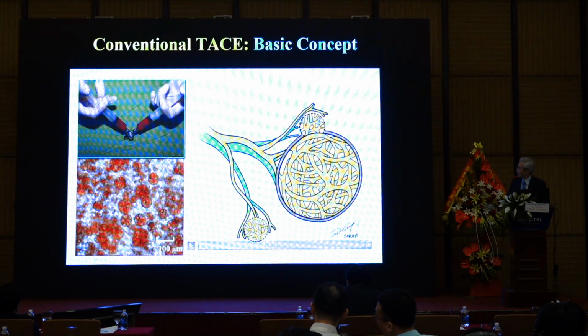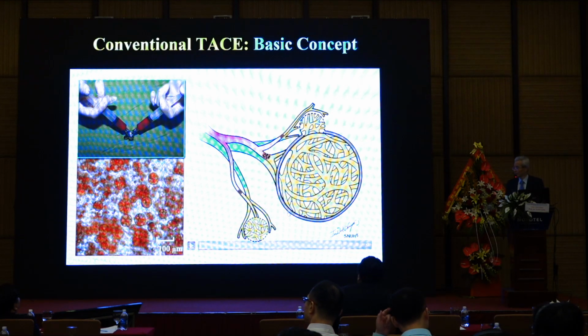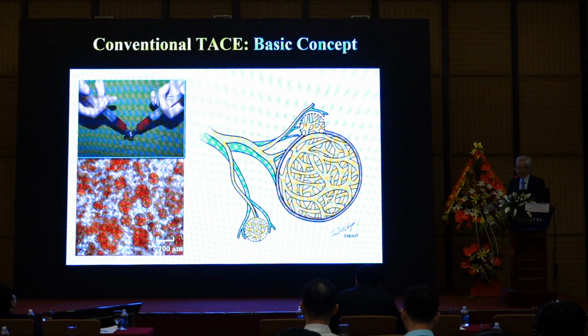But in this kind of case, in early stage of the Lipiodol injection, we can see a very good tumor uptake. Never stop infusing the Lipiodol. In small HCC, you should continue to inject until the filling of peritumoral portal vein. Otherwise, if you stop at this stage, maybe this part and this small early stage HCC may survive without complete devascularization.